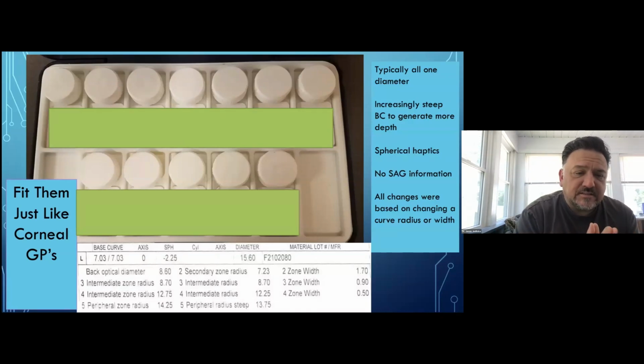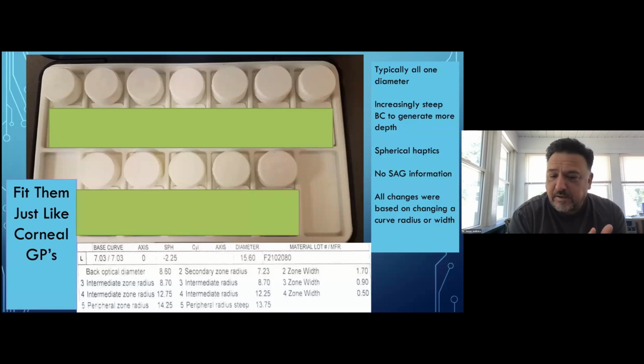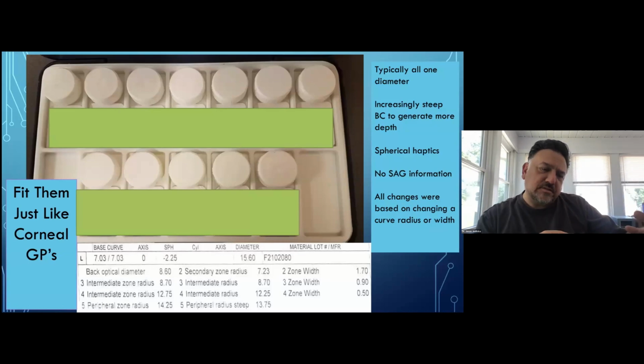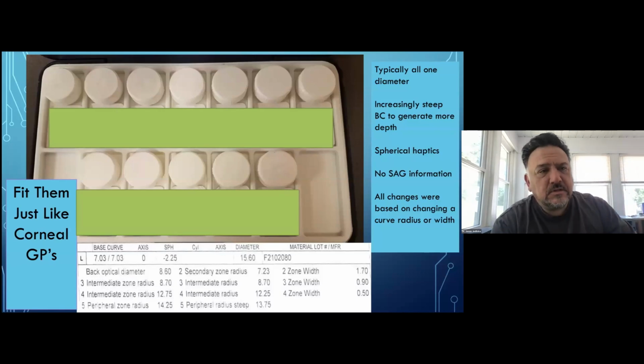Similarly, our first diagnostic sets were fitted a lot like corneal GPs. You see here a given set of lens parameters, and even modern lenses essentially to an extent work the same way. They're a series of curves or things like that, but how we go about determining those curves and deciding what they are, we don't necessarily do it by virtue of ordering a certain base curve and a second curve and a third curve, radius and width. A lot of this is already in the software that's going to make that lens. And all we really are looking at now is we're really driven towards the elevation part of it and how much clearance we need, clearances more than anything. And then we just trust that the design software that makes that lens is going to generate those clearances the way we want them to.